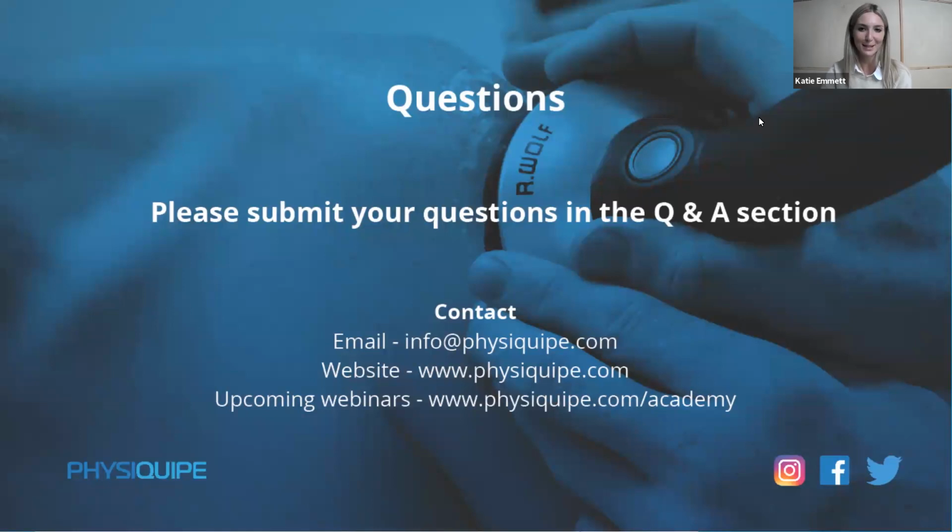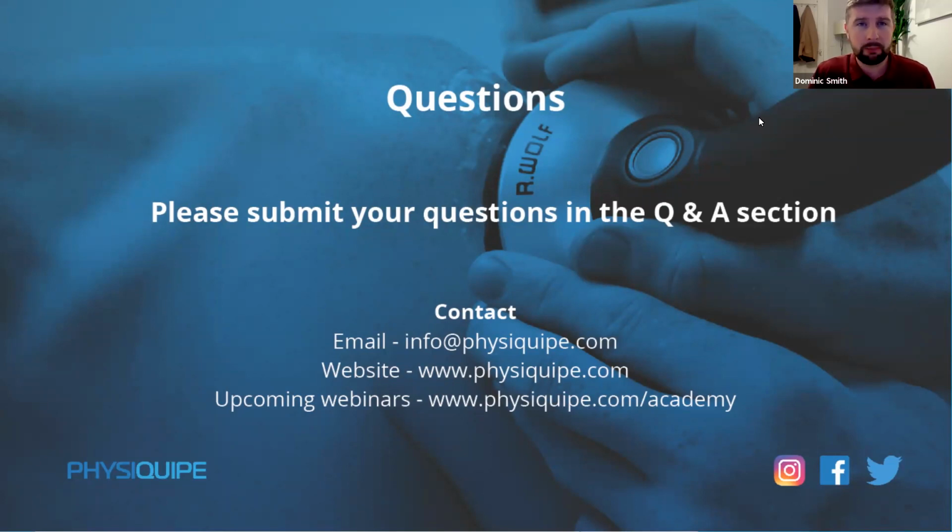Great. I think that's fair. Yeah, I'd use clinical experience. Some people will probably say, yeah, if you're away from the area, like wrist, elbow, then probably no problem. But I know you can look at the International Society of Medical Shockwave Therapy, the ISMST. They've got their list of contraindications, indications, and advice there.